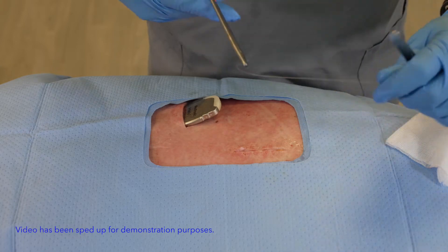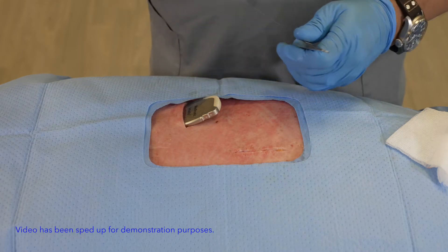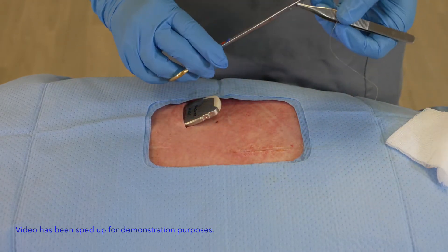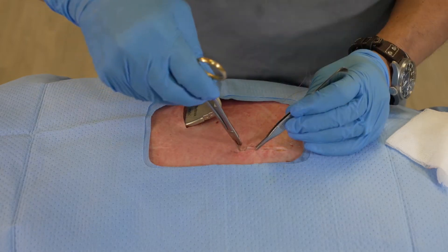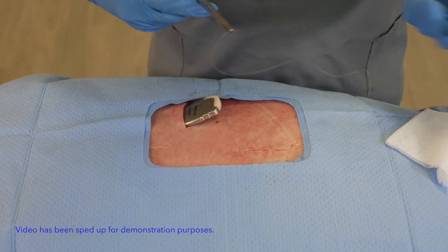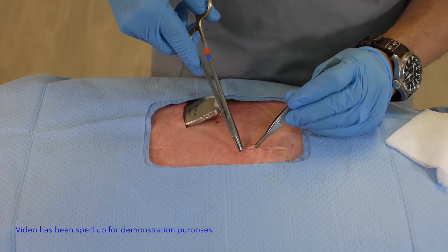Once I've done that I can perform the same type of run that I did on the lower layer, doing my superficial run in the same manner. As I walk through each of these maneuvers I want to make sure I'm paying particular attention to the approximation so that it remains equal and consistent on both sides. Again, I'm not worried at all about how much tension I'm placing on the actual incision because the locking mechanism of the suture is working in my favor.